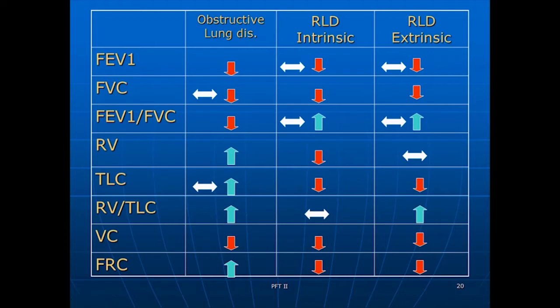Again, we looked at spirometry, flow versus volume. Then we looked at all of our volumes and capacities, and if those capacities and volumes were low, that usually meant that there was a restrictive component. If they are normal to increased, that means that there's usually an obstructive component, because we said obstruction has no problem with volume. The restrictive does have a problem with volumes and capacities.